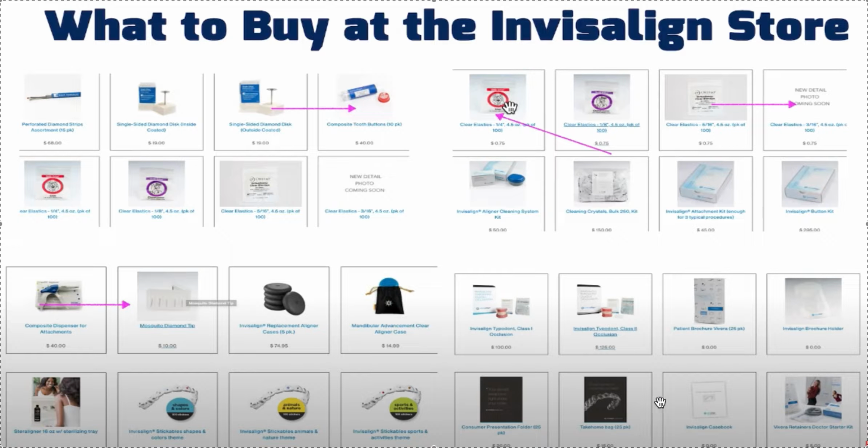So definitely, I think their buttons are the best. They are crazy expensive though. I think they're like $4 each or $5 each. And if you end up doing elastics, I would definitely use their buttons. Just the shape of them, they're patented. They really hold the elastic well, regular buttons don't. So hands down, they're the best buttons. Of course, when they lose and break them, it can get expensive. But yeah, a couple bucks each. That's them right here.